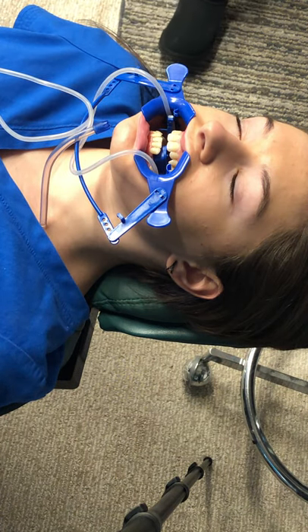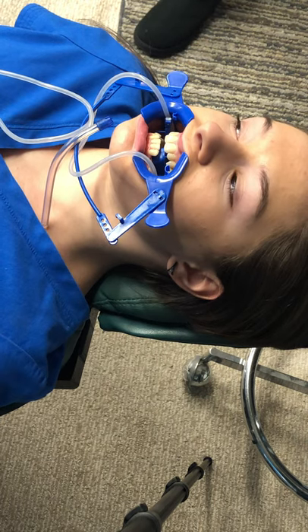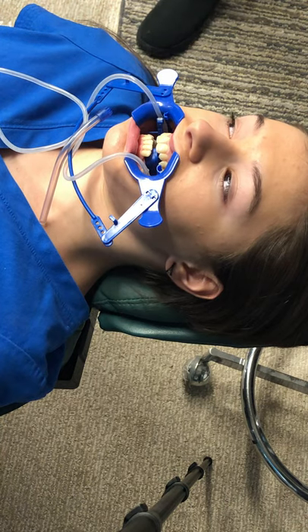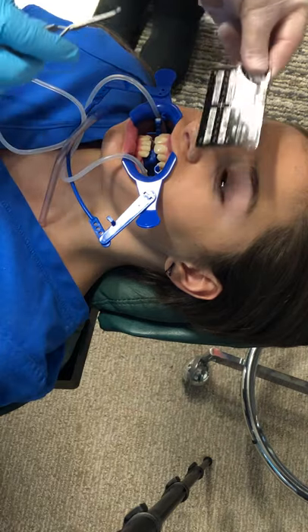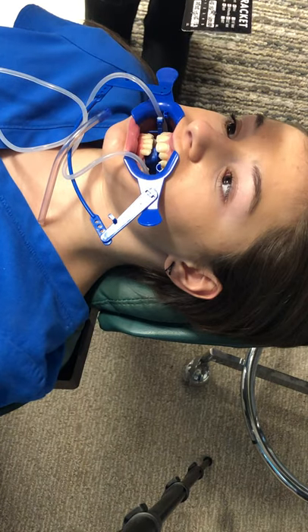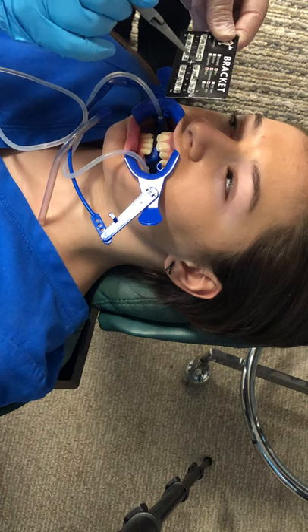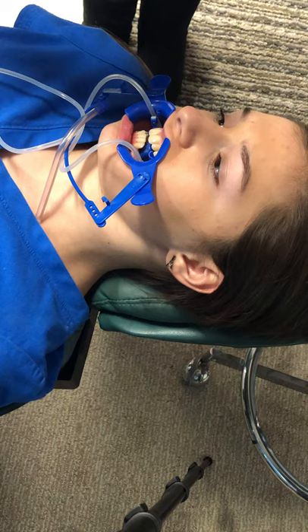We are ready for the braces. This is your bracket holder, and it's set up just like her mouth. You see those cross marks? It's what I drew on the board — there's your midline, upper left one, upper left two, upper right one, upper right two. I'm going to take this off.